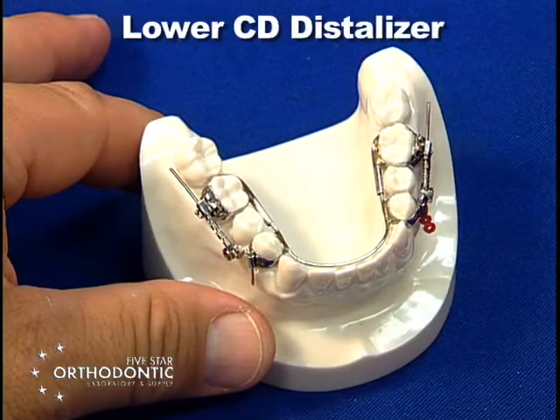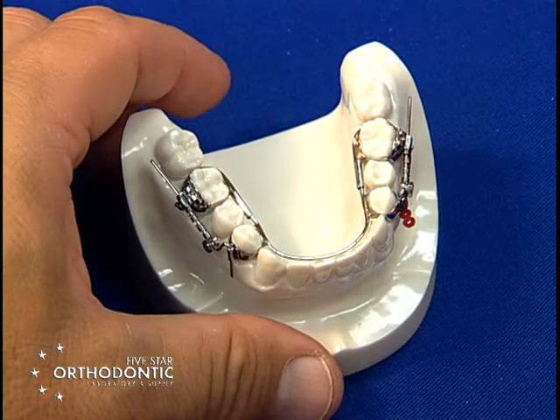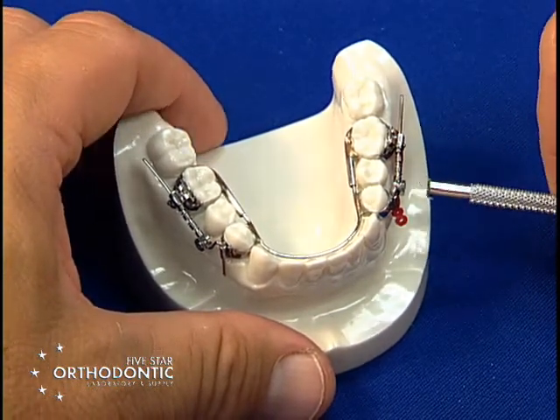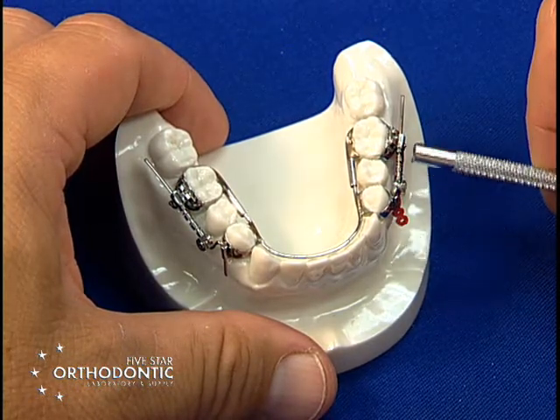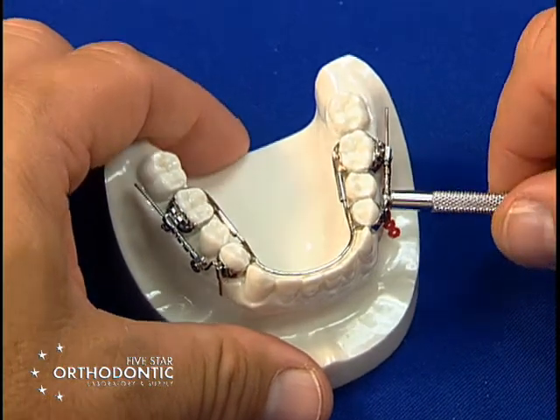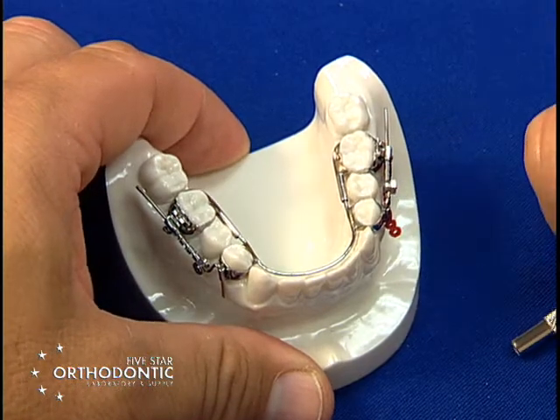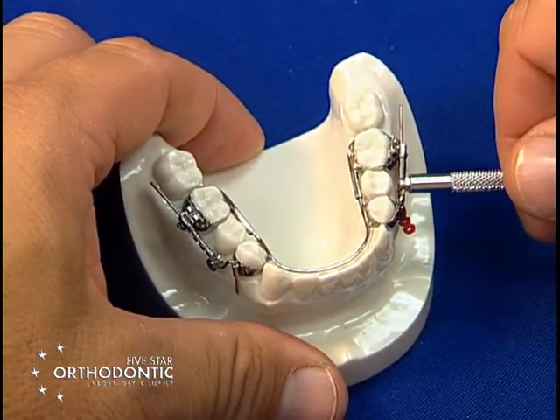This is a lower CD distalizer used to distal drive molars. You have a coil spring, which is on a lever arm with an arch wire lock used to compress the spring. You have a dual arch wire lock wrench that you place on the nut, loosen the nut, compress the spring, tighten the nut down, and that activates your appliance to distal drive the molars.